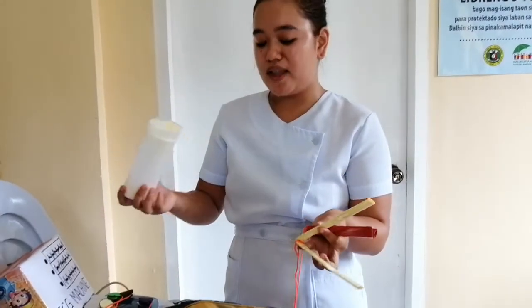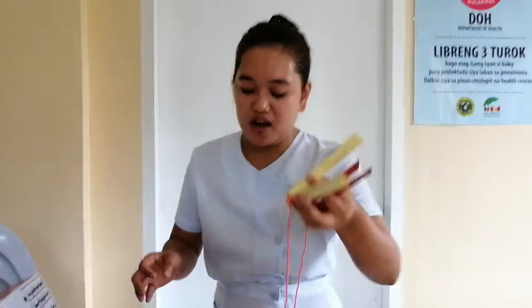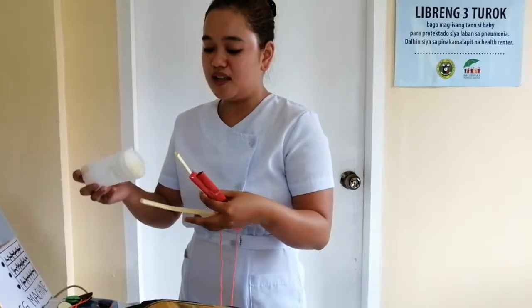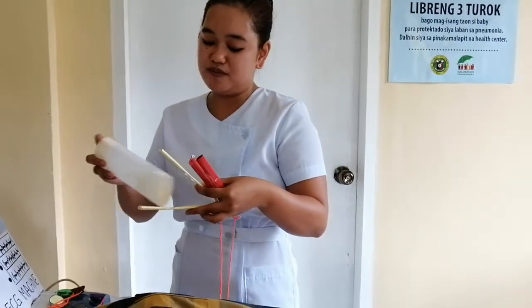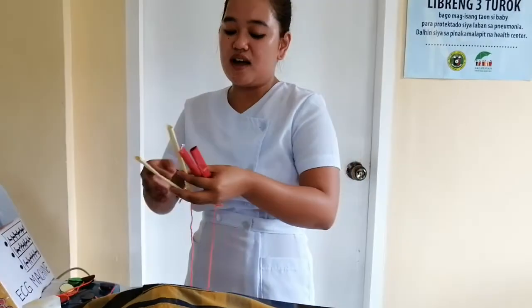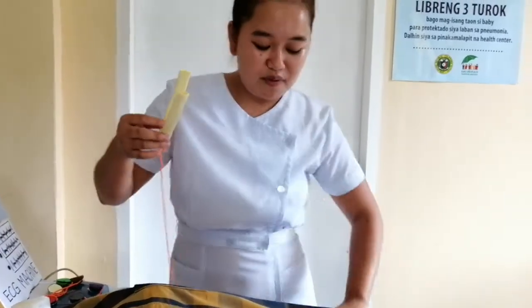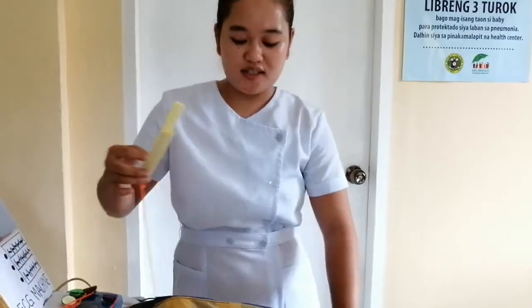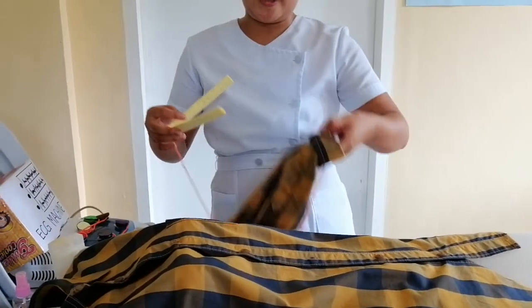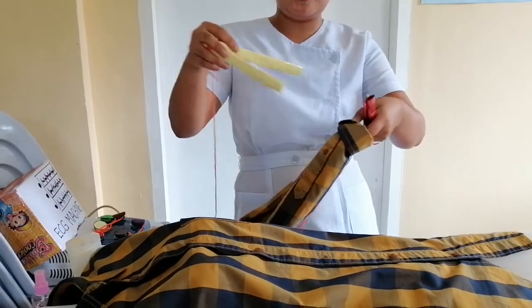So the yellow one will be placed on the left arm. So place an electrogel, just assume. Then place it on the left arm of the client. So this is the left arm of the client. Assume that this is the arm of the client. I'm going to place it.